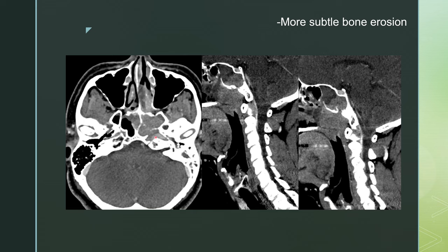Here is a more subtle case of bone erosion. On the axial image, you can see discontinuity of the posterolateral wall of the sphenoid sinus with soft tissue density material within the sinus itself. On the sagittal view, you can see a defect extending from the nasopharyngeal mass into the sphenoid sinus, and an even more subtle defect in the dorsal aspect of the clivus with soft tissue on either side going ventral to the basilar artery. This also counts as bony erosion.